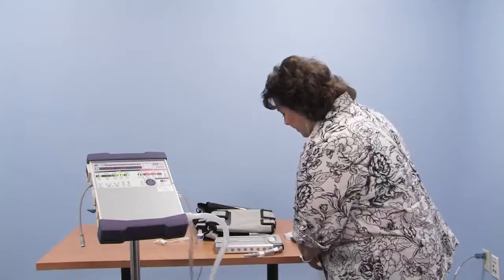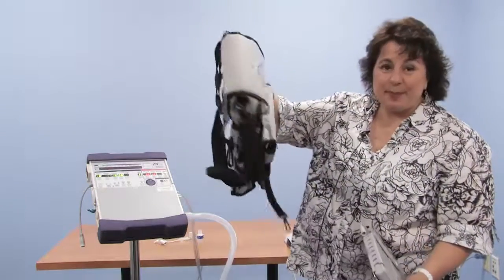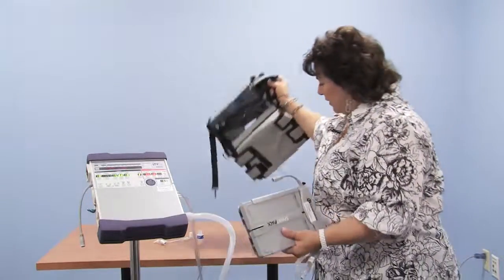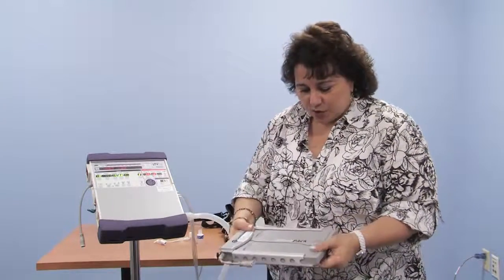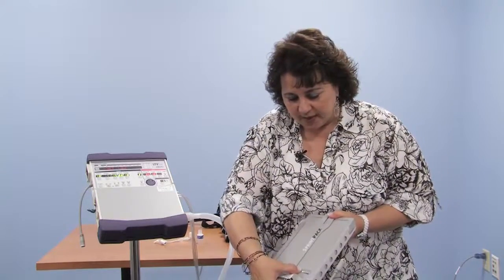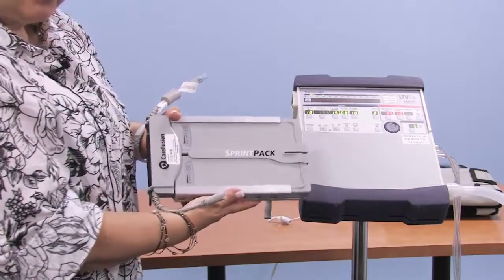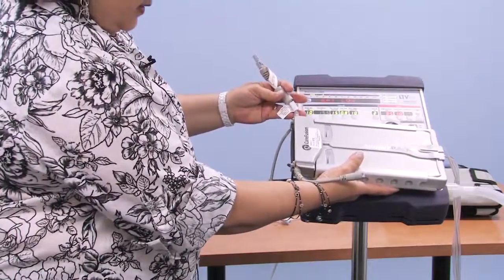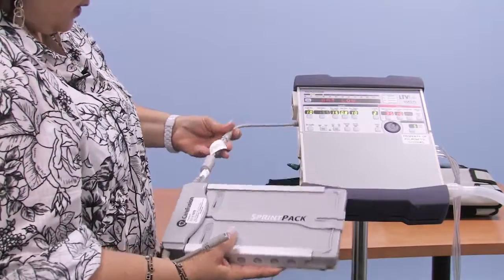What I'm going to show you is, for travel, there is a knapsack, or excuse me, I guess it's more of a carry case. The battery fits right in the front here. It's called the Sprint Pack. It is two 3-hour batteries, all in sequence. There's a button that you can press to test and see how full they are. The Sprint Pack is the portable battery for the LTV series ventilator, which fits in the case that I showed you. It mounts in the front of the ventilator here, and the power will be connected, as all the other power connectors are, to the ventilator.